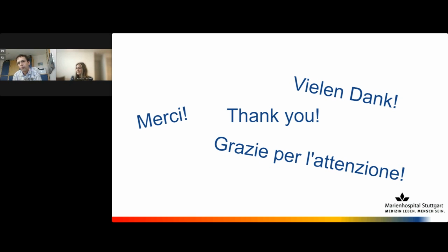Great. And is there a difference in running FLC kappa lambda manual versus automated? We've only done this on the automated platform. We are not doing this with manual ELISAs, because you have to do the dilutions, and you have some repeats and so on. And you have quite a large number of samples, and I don't want to get this messed up.